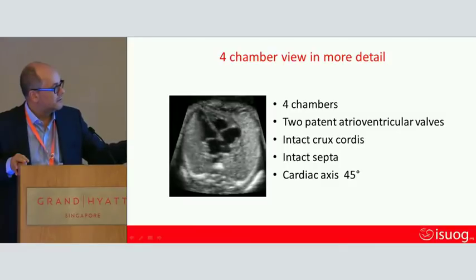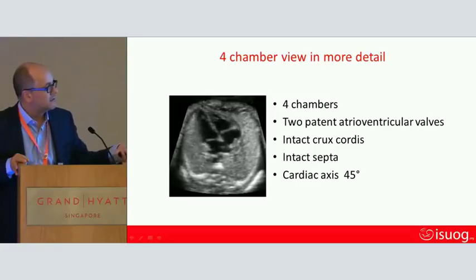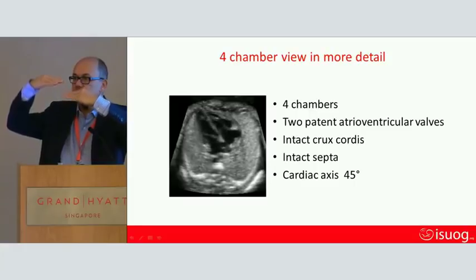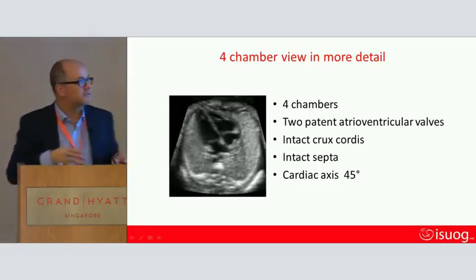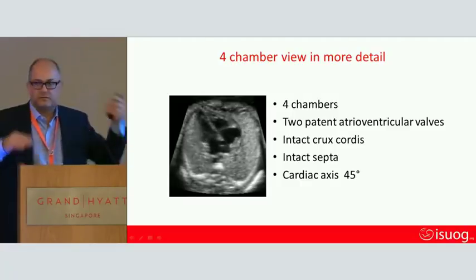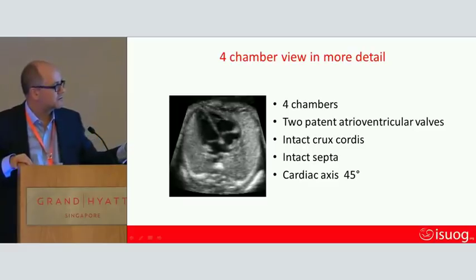You can see the 2 atrioventricular valves. You can see them opening and closing nicely. And can you see that the valves are not exactly in the same place? They have a little offset. That is called the offset of the valve. And in the middle of the heart there is the cross, although it's not really a cross because the valves are offset. That's called the crux.